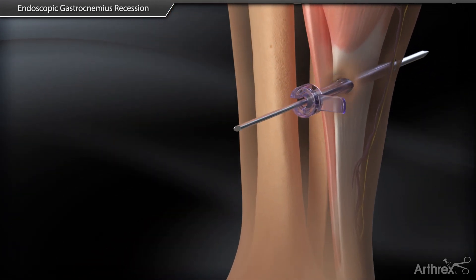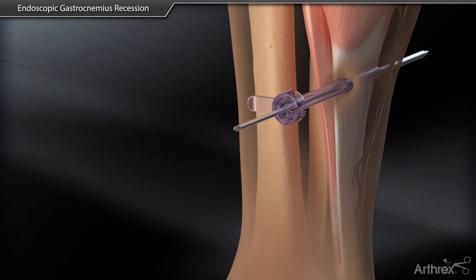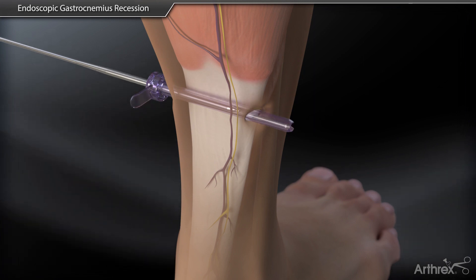The cannula is then removed, turned 180 degrees, and reinserted. Rotate the cannula to where the open slot is facing the tendon and remove the plane finder.